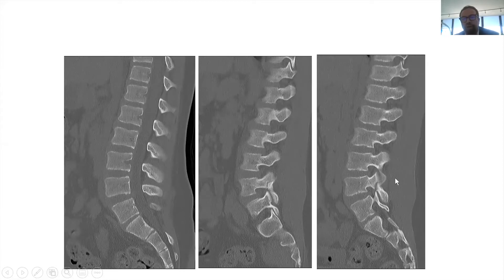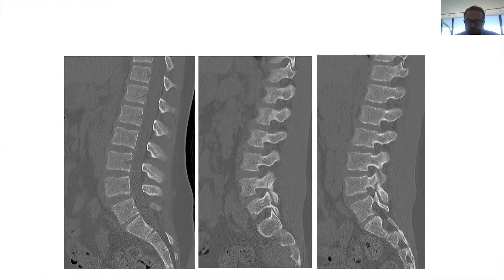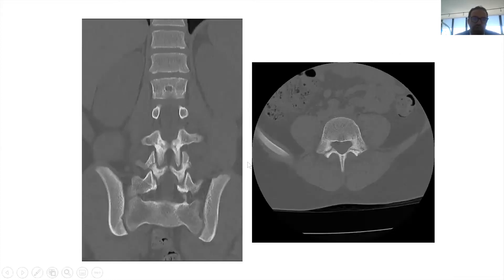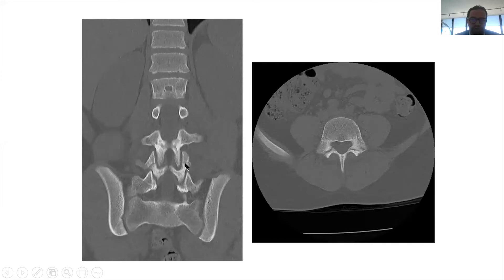When we look at fractures, we assess whether it's stable or unstable. This is a stable fracture, so we start by managing it with bracing. This coronal CT is showing the pars fracture — you can see a normal pars at L3, but there's a fracture line on both sides.